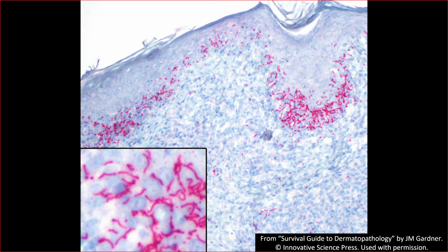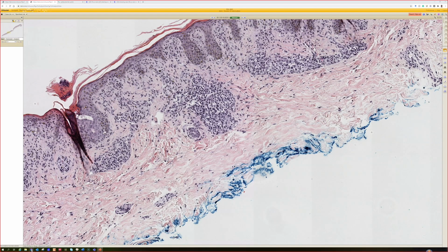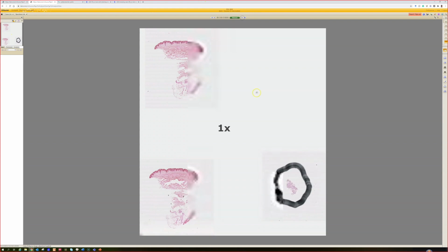And then there again is the spirochete immunostain. And I have seen a few cases that had no epidermal change and just perivascular lymphs with plasma cells. So if in doubt, do the stain or recommend RPR or additional testing if there's any doubt clinically, okay? And I'm going to just skip past this one, 17, because I personally could not find the organisms.